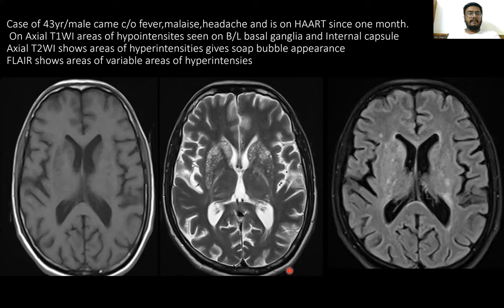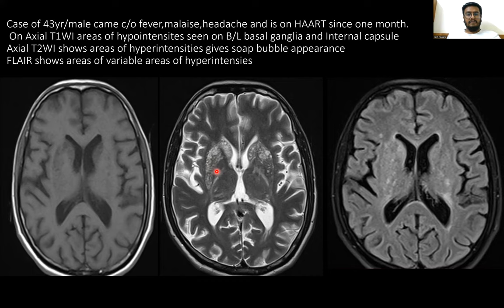Here is a case of a 43-year-old male presenting with fever, malaise, headache, and on HAART for one month. On axial T1-weighted images, there are areas of hypo-intensity in the bilateral basal ganglia and internal capsule. On axial T2-weighted images, hyper-intensity lesions coalesce to form a soap bubble appearance in the region of the basal ganglia and caudate nucleus. On FLAIR, there are variable areas of hyper-intensities.